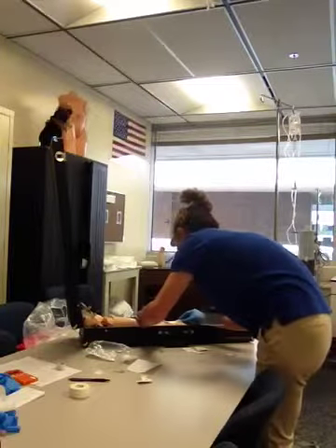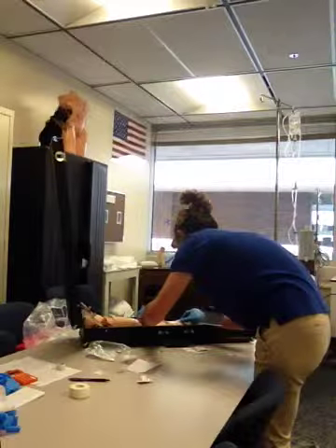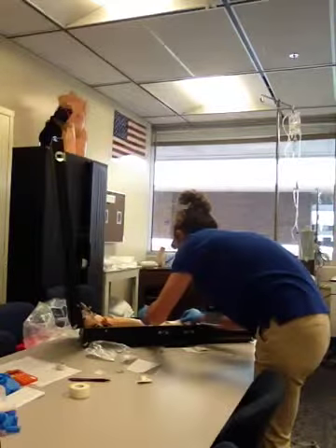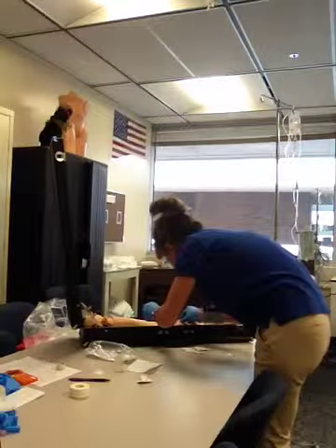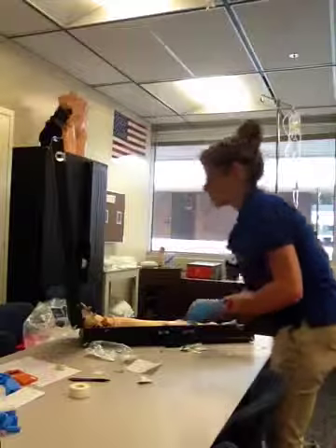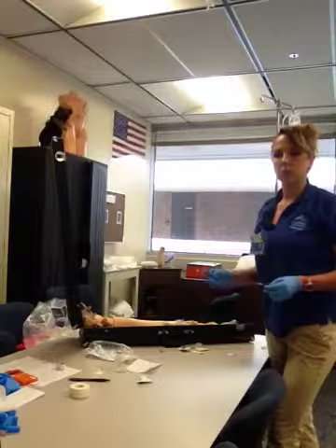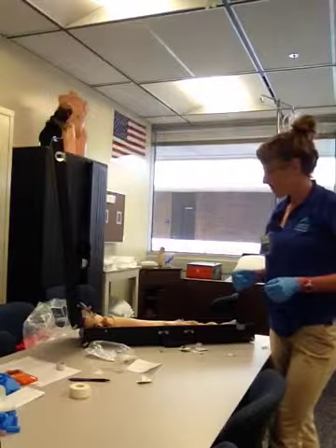And I want to do a push stop flush of saline, 3 milliliters. And hold and clamp. And I'm going to remove this wrench. Depending on the hospital policy, some hospitals you would then do a heparin flush following your saline flush.